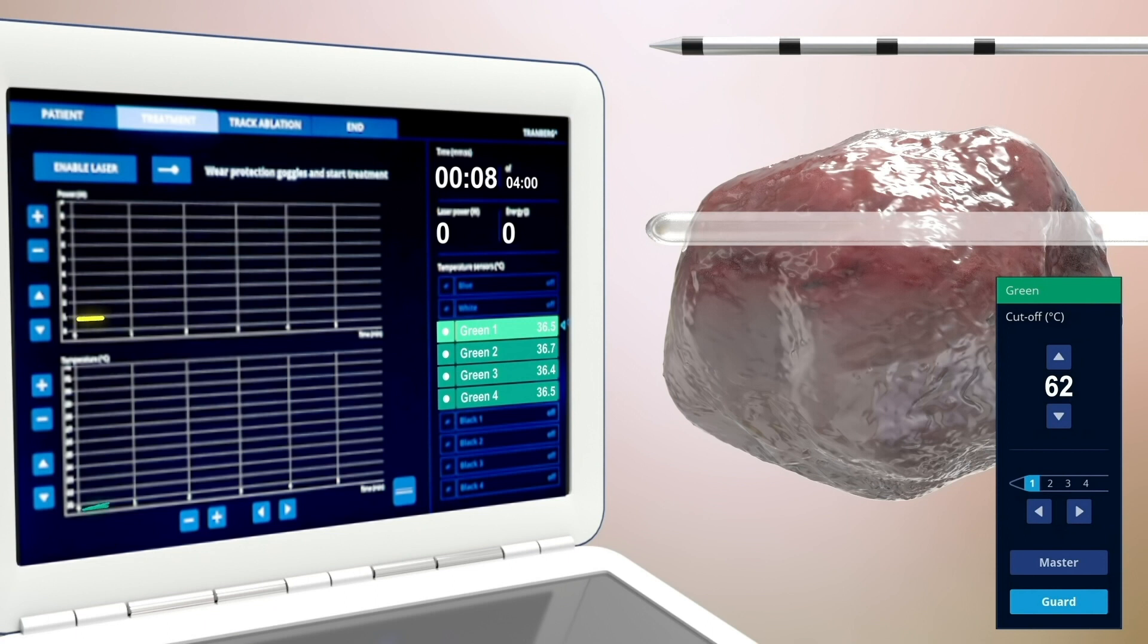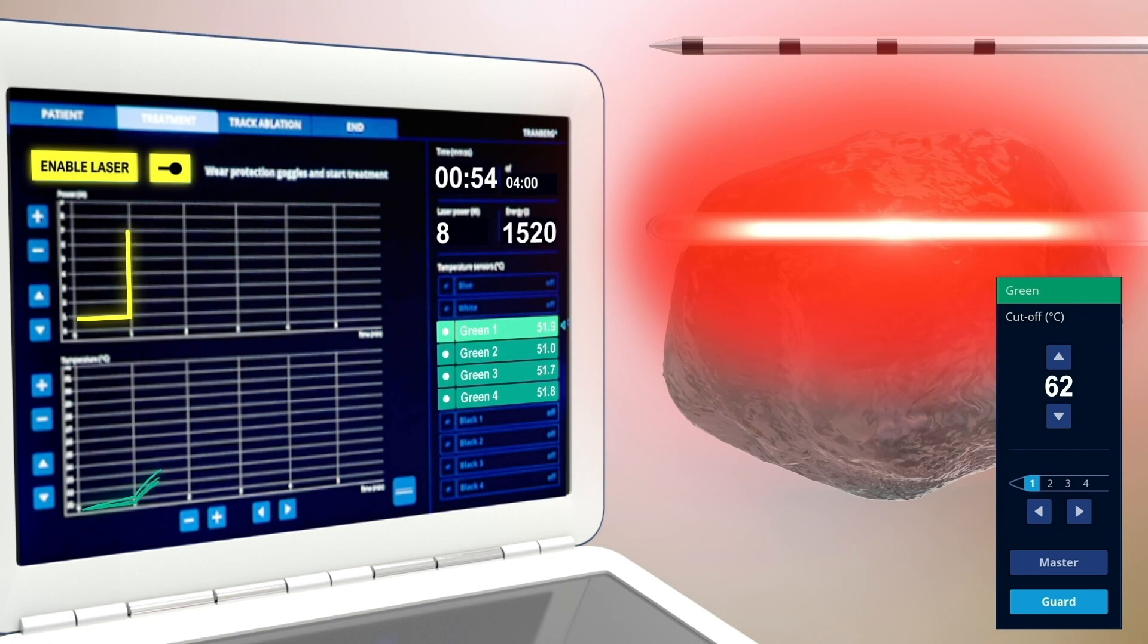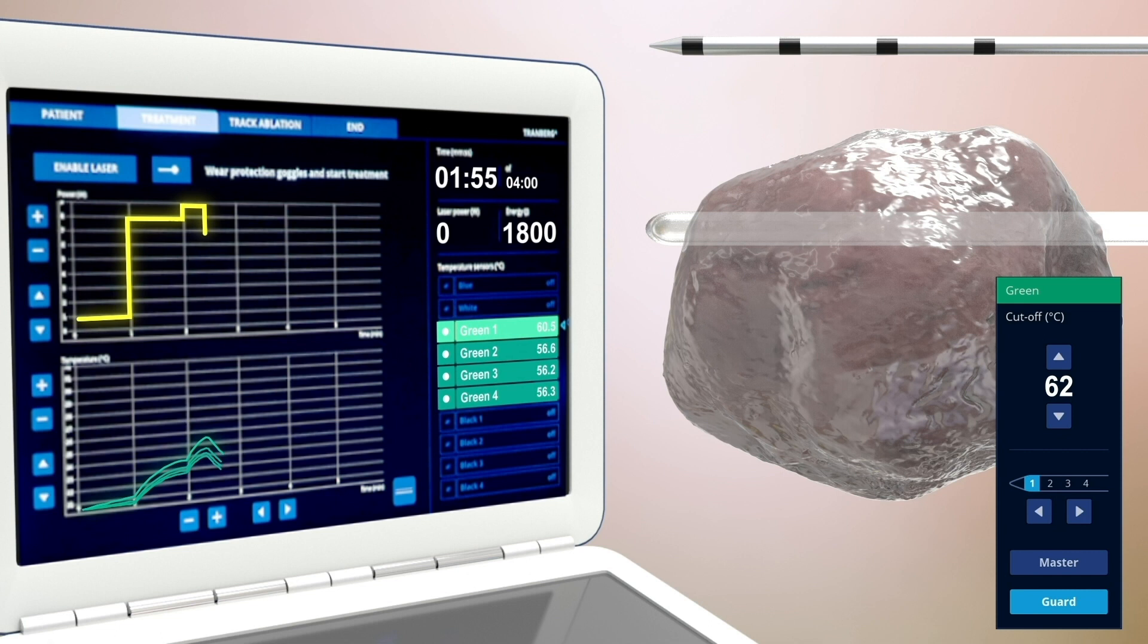A temperature probe is selected as the guard, and target temperature is set. Once the temperature is reached, the laser automatically quits emitting and goes into standby.